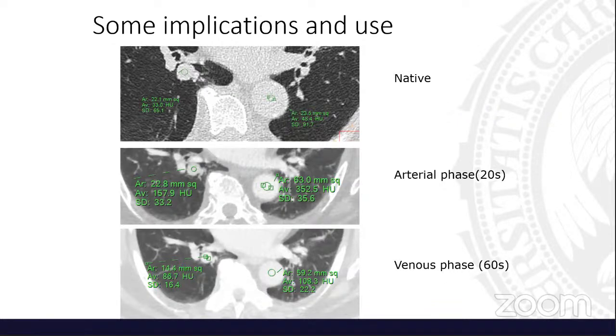This means that it's like washout, because it gets out of the veins. So this dynamic, for example, tells us that the probability is really high that this is just a vascular thing, and it's probably an AV malformation. So we can work with the densities like that.